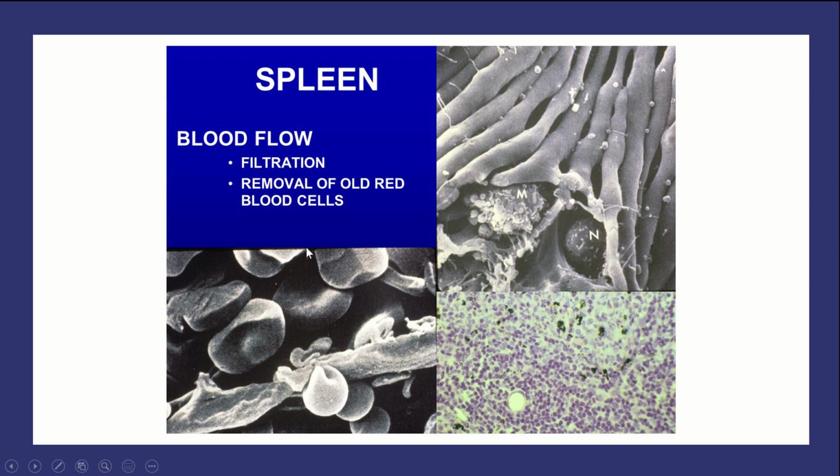So there we go, and here we can see how those littoral cells work in the spleen, right? Because the function of the spleen is to filter blood, and so we have all those white blood cells to come in contact with antigens, but we also need to filter out old red blood cells. And so we have these littoral cells. The way I think of it is the two T's in littoral make a gate. So they make a little gate, and they line up like this, so there are only very small gaps in between the littoral cells. If you are a new fresh red blood cell ready to work, you are very flexible and can very easily squeeze in between these holes.